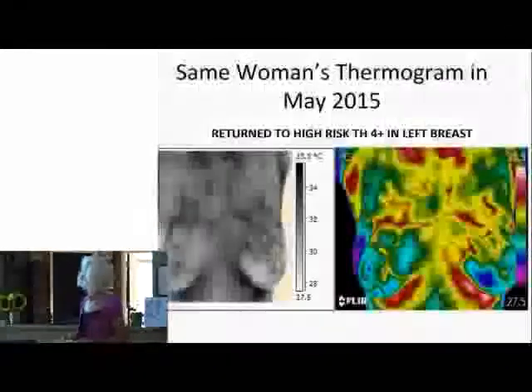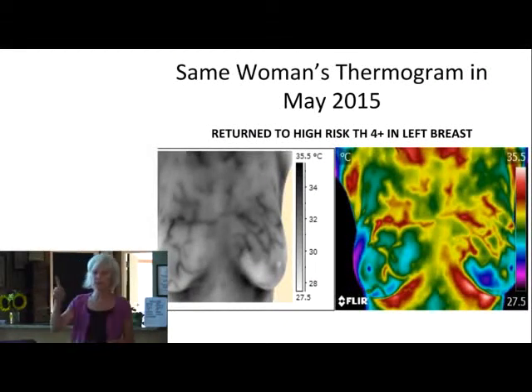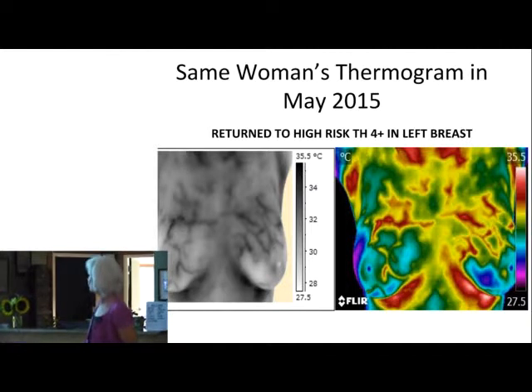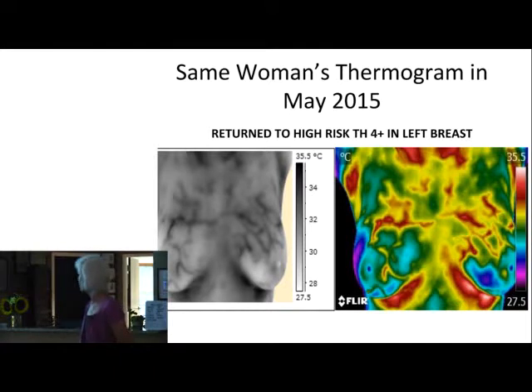Next one, Effie. Okay, this is the same woman. This was in January of last year, and she came back in May of 2015, but she didn't do any therapies anymore, and she returned right back to high risk in the left breast. So that was for a temporary 1 week period when she was doing this therapy. And this just goes to show you that usually it takes more than one thing and you have to keep at it and not just do it for 1 week and not do it anymore. Exactly, it's not a quick fix. But that's just to show you that she, in the rainbow and the black and white, the grayscale, unfortunately went right back up to high risk in that breast. But you know, the very nature of what she does, she has to do more to keep her breast healthy.